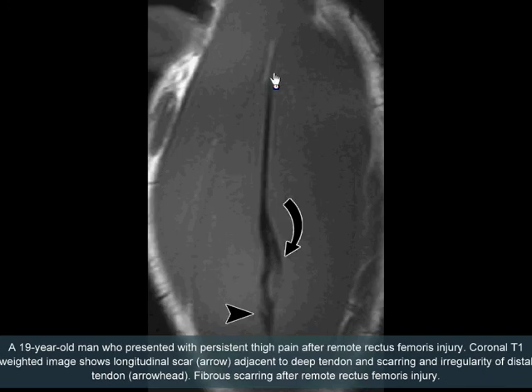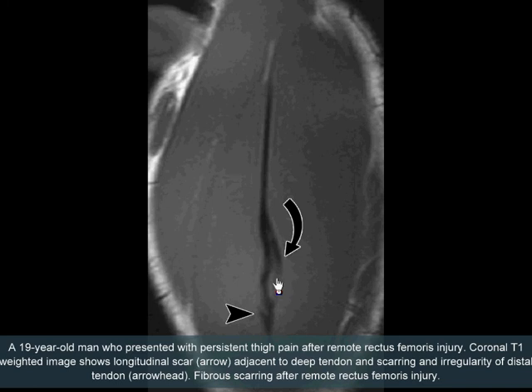This is a 19 year old man who presented with persistent thigh pain after remote injury. Coronal T1 weighted image shows a longitudinal scar adjacent to the deep tendon and scarring and irregularity of the distal tendon, consistent with fibrous scarring after remote rectus femoris injury.